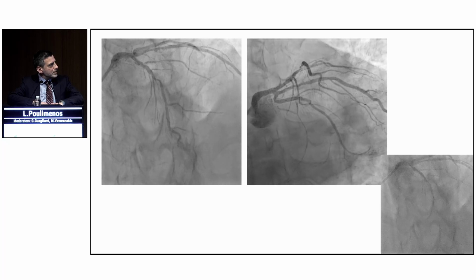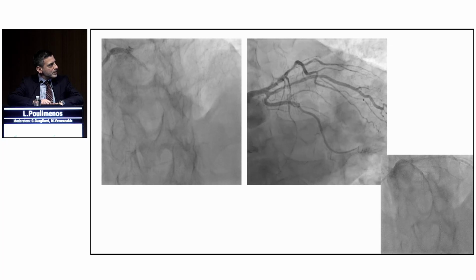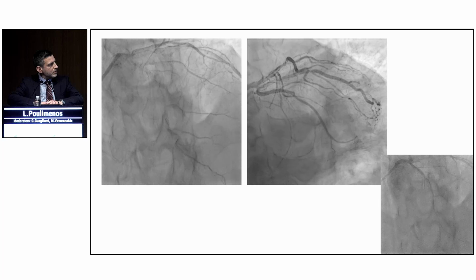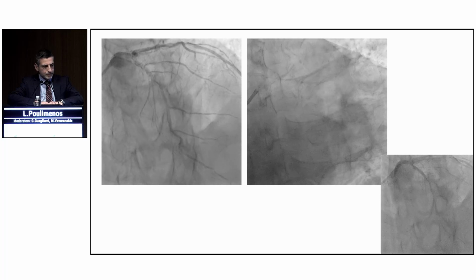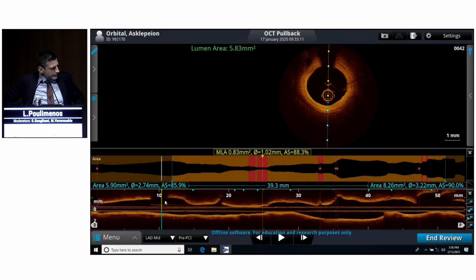You can appreciate the calcium. You can appreciate this peculiar finding at the very proximal part of the LAD, and you can see that the first obtuse marginal has a fair amount of disease, but nothing more. And then we proceed to imaging. So we did an OCT. Please change to the OCT screen, and Professor Guagliumi can describe what we are seeing.